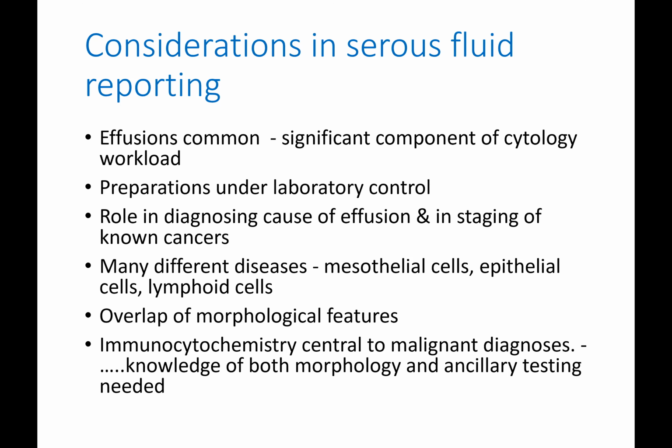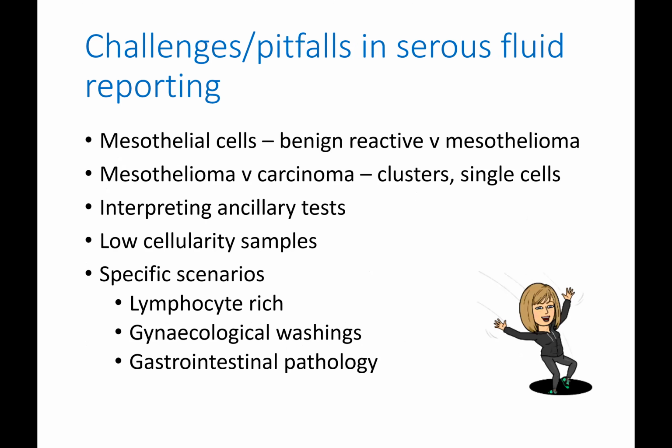With serous fluids, however, there are many different diseases to consider and many cell types, including mesothelial cells, epithelial cells, and lymphoid cells, and there's also an overlap of morphological features. This means that immunocytochemistry is often central to malignant diagnosis, and we need knowledge of both morphology and ancillary testing in diagnosing serous effusion lesions. As a result, we're not short of challenges and pitfalls in serous fluid cytology reporting.